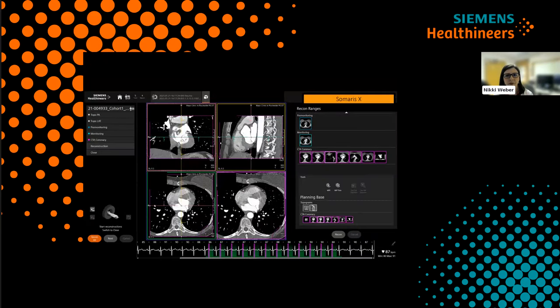Whether you are performing a reconstruction from the scan console while the exam is still open, or if you reopen the exam to do additional reconstructions, the most important thing I want you to know about is that there are unlimited recons. But we'll get back to that awesome feature in a moment.